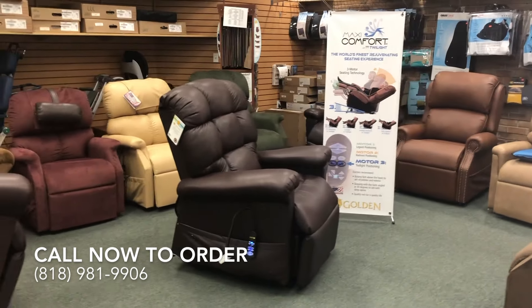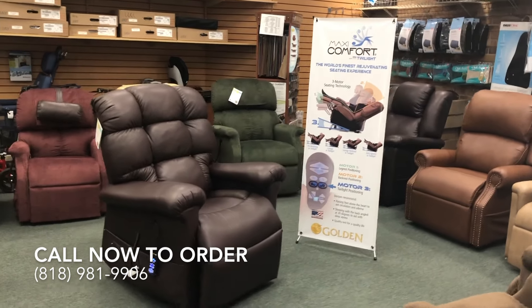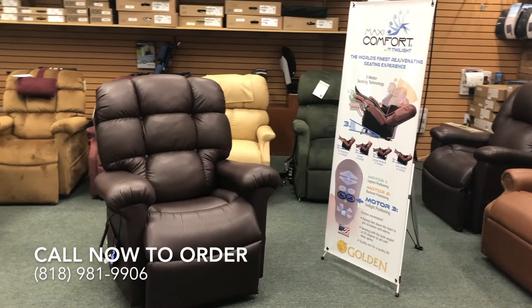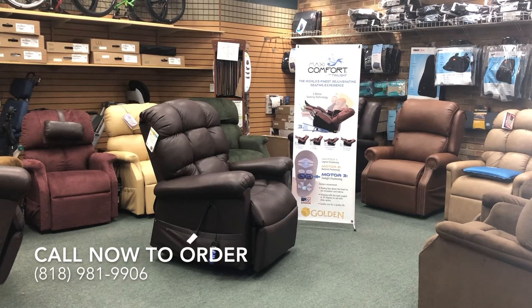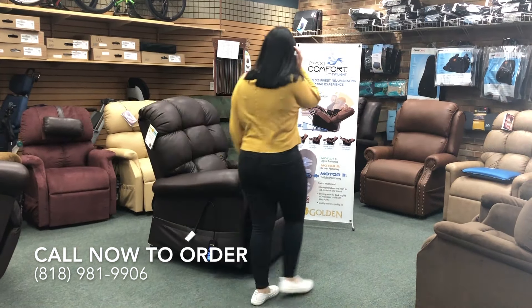Hello and welcome to Sherman Oaks Medical Supplies. Today we will be discussing the new Golden Technologies MaxiComfort Cloud with Twilight Zero Gravity Lift Chair. With a weight capacity of 375 pounds, this chair is suitable for people of all sizes.